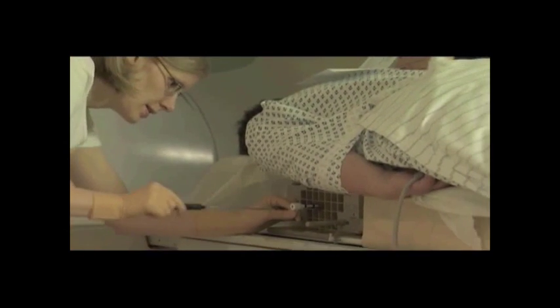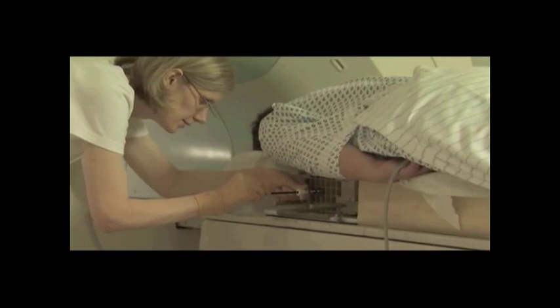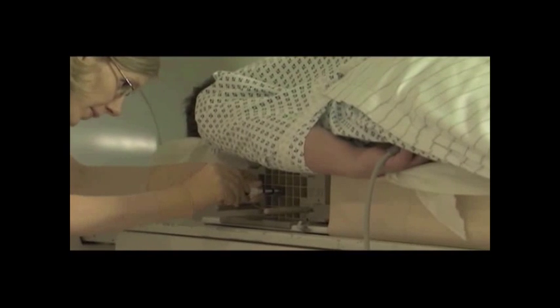While continuing to hold the introducer sheath in place, remove the stylet. Place the localizing obturator into the introducer sheath. Make sure that all instruments placed into the introducer sheath are inserted completely, hub to hub.